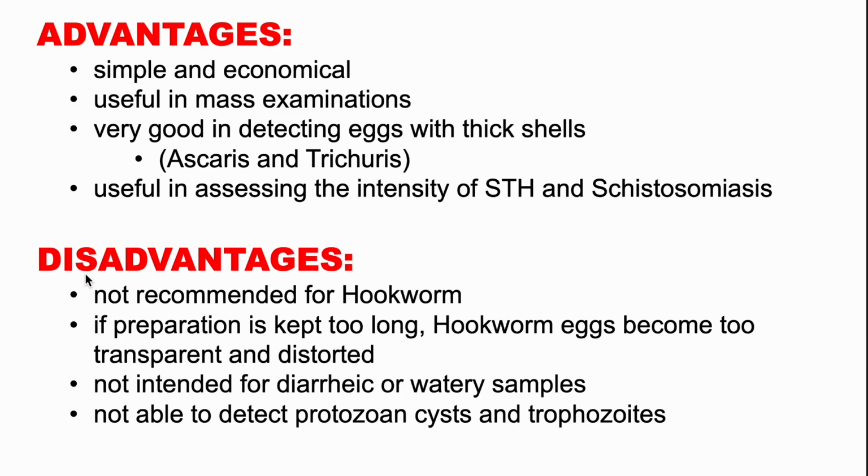For the disadvantages, it's again not recommended for hookworm. If the preparation is kept long, the hookworm eggs become too transparent and distorted. It is also not intended for diarrheic or watery samples, because you have a template, you pick up the stool and just spread it along the template. It is also not able to detect protozoan cysts and trophozoites.